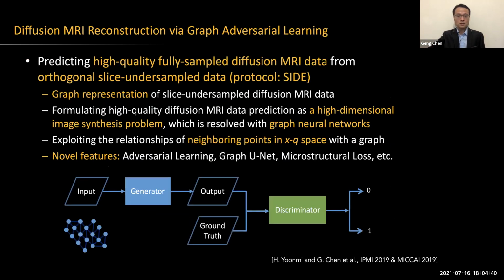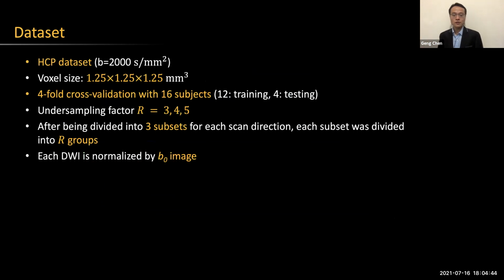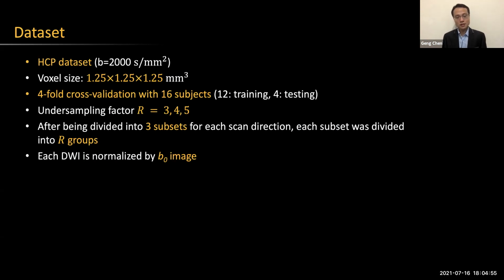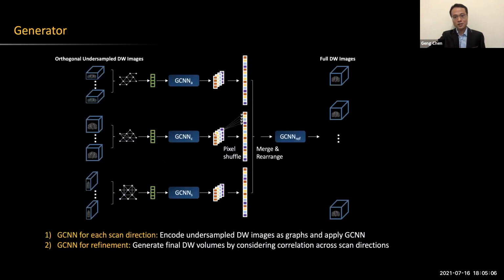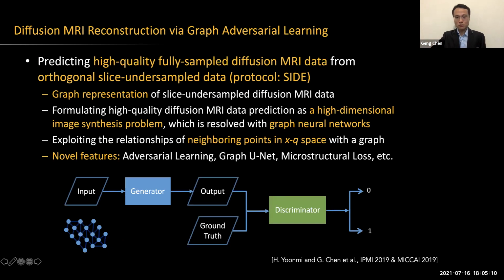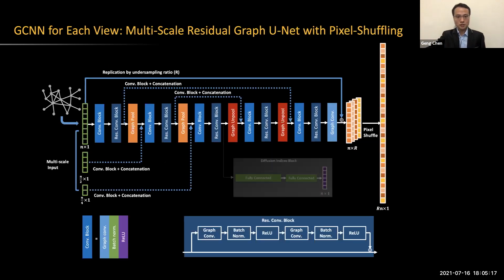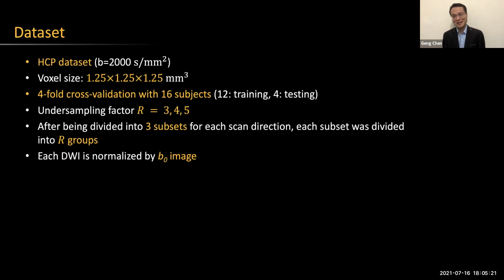And for this work, we are using patches to do the training. Because we are using patches, we can extract a lot of patches from the data. For some details, because this work was finished in collaboration with Dr. Yomi Hong, I may need to check the paper. I don't remember exactly how many patches were used in this work, but based on the experiments, these patches are sufficient to train the model.